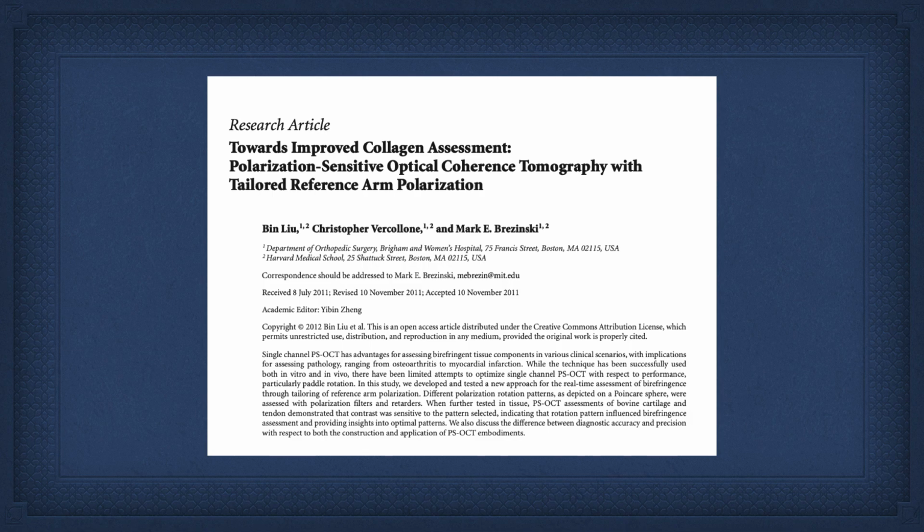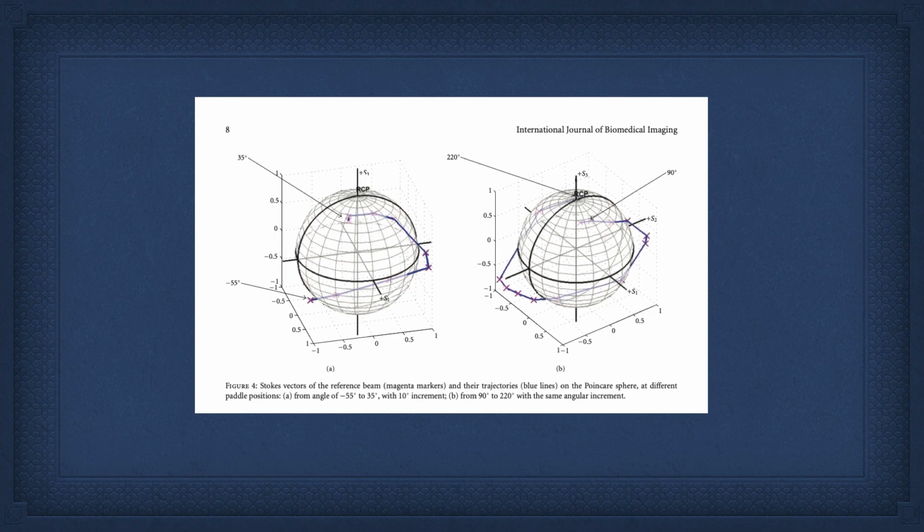Now, we actually can determine the polarization state by knowing the positions of the paddles, and we have that information if we really needed it, just like you could do densitometry if you felt like it on a chest x-ray. And we can plot the data.